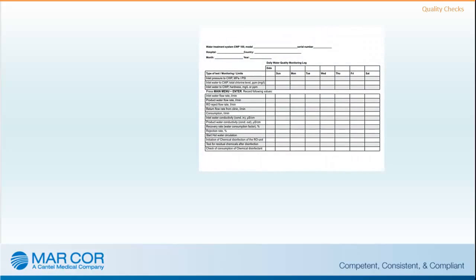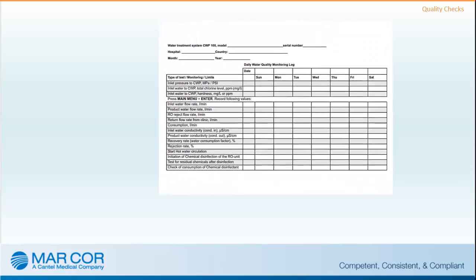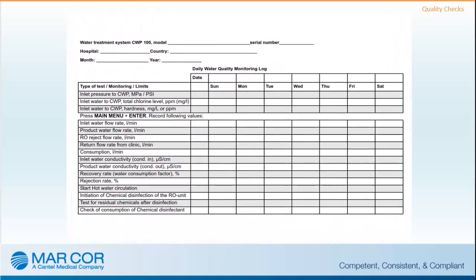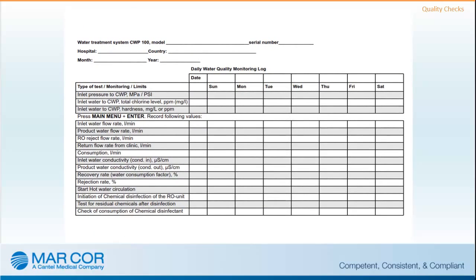Quality checks consist of testing and recording CWP measurements daily in log sheets and monthly bacterial testing. To get an indication of the water quality, the CWP unit measures conductivity through water, expressed in microsiemens per centimeter. Conductivity is a measurement of dissolved salts in the water and should be used as an indicator of the performance of the reverse osmosis system. The water produced by the CWP unit should be analyzed on a regular basis to verify conformance with regulations or standards for dialysis water.